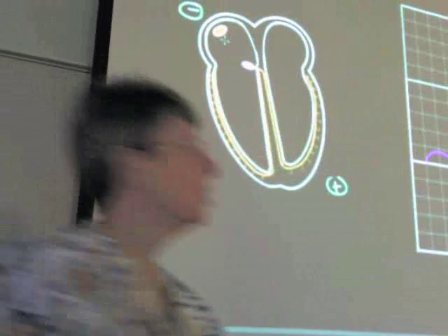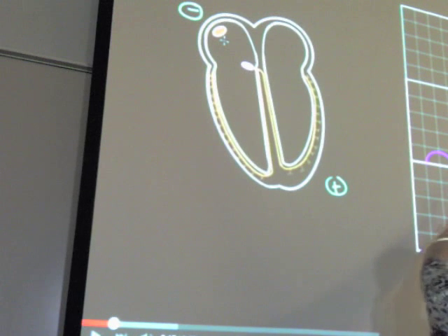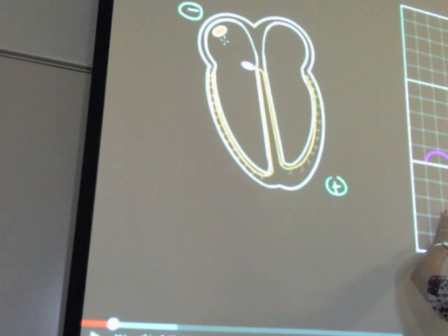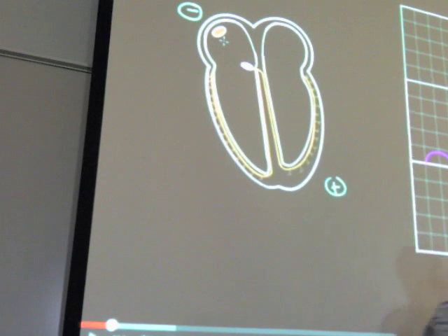All right, then the next few that you see are this waveform, the one that goes all the way up to the top in orange and then comes back to the baseline, and then the one that goes below the baseline, still in orange, and back up to the baseline.